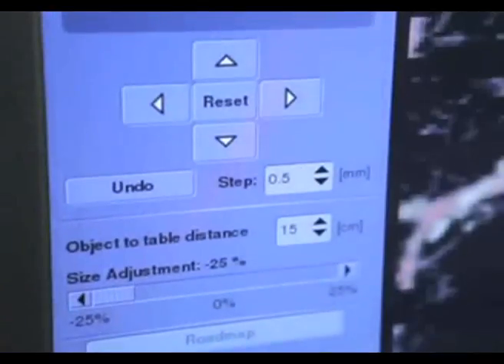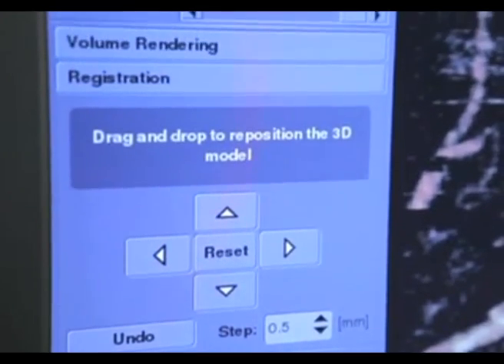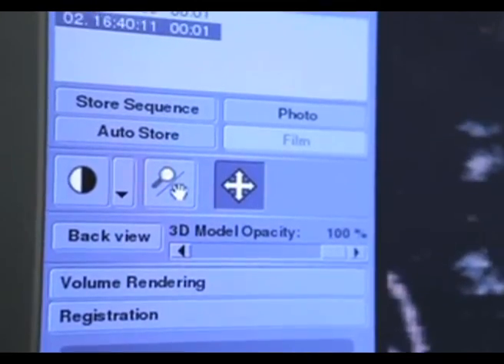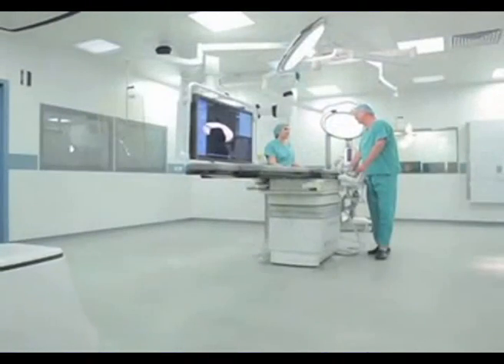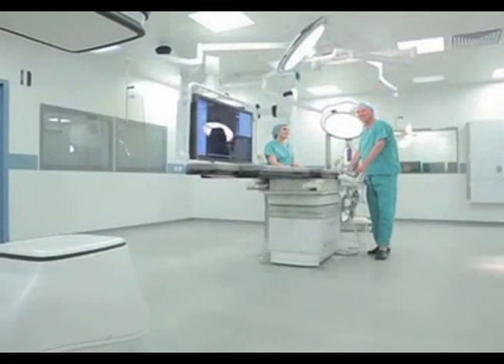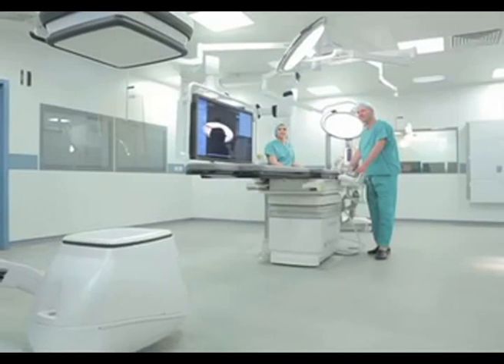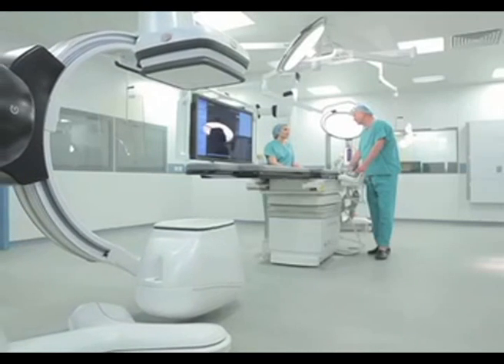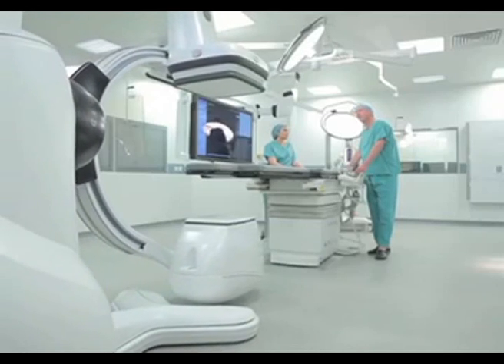Modern computerized imaging systems make it possible to upload already existing CT scan data to the system and then merge them with the live images created at the time. That makes it possible with this overlay to navigate through the vessels of the patient, and this is called fusion imaging. So this fusion technology reduces the dose area product for the patients and reduces the amount of contrast we need to give. Pretty much all the high-end systems on the market are able to do this, but it is so far something which takes a lot of pre-planning and is cumbersome.